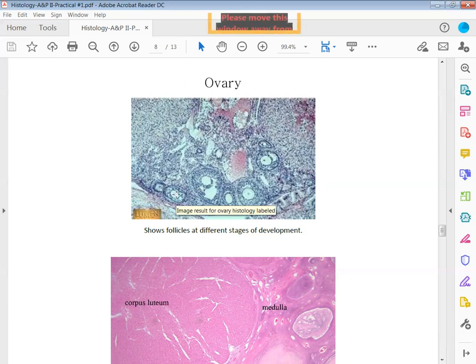And inside the ovary, you have eggs at various stages of maturity. So that is the reason you're seeing a lot of these with different looks, okay? So again, in the ovary, what you're looking for are these follicles with these eggs at different stages of development. So this organ or gland would be an ovary.